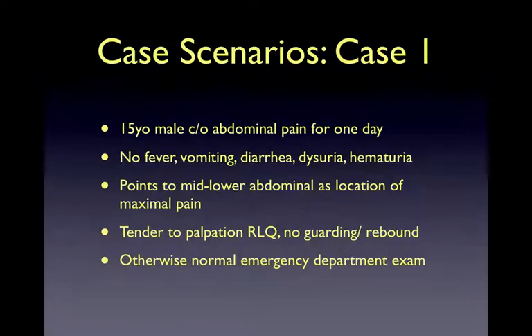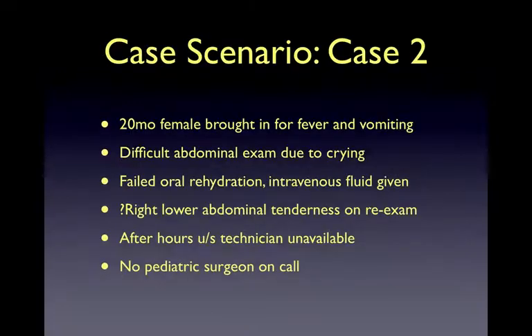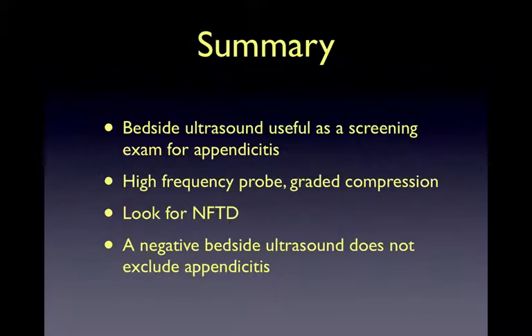Going back to case number 1, you have a low to moderate clinical suspicion for appendicitis. A positive bedside ultrasound should be enough for you to convince a surgeon to take him to the operating room, while a negative ultrasound does not necessarily rule out the condition. In case number 2, your clinical suspicion is a little lower. Bedside ultrasound can help you look for conditions such as intussusception and appendicitis and make a timely disposition in case of positive results. It is reassuring in case of negative results, but I would recommend getting a formal study if symptoms persist.